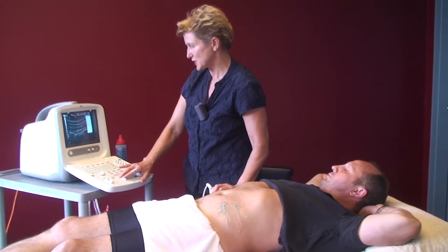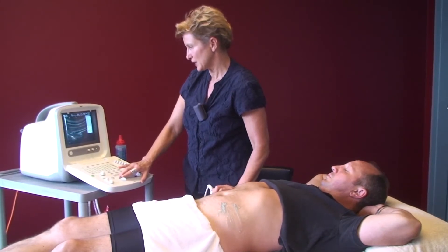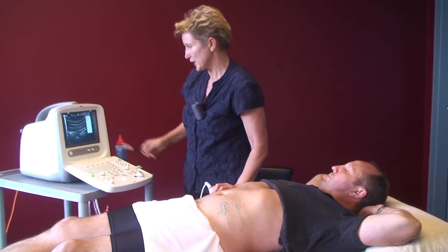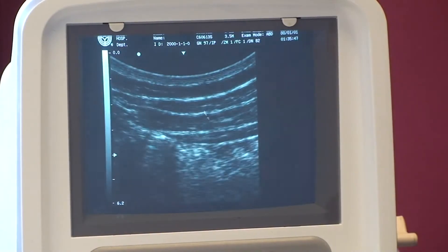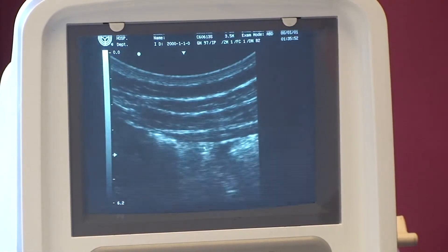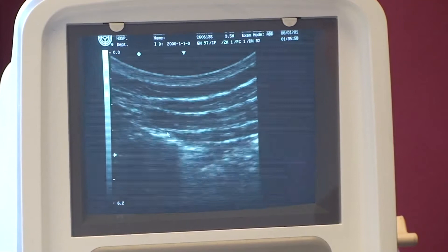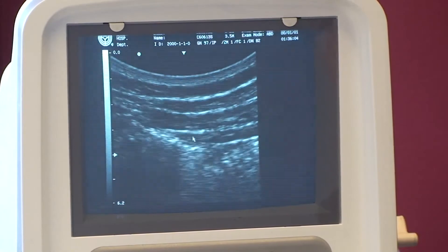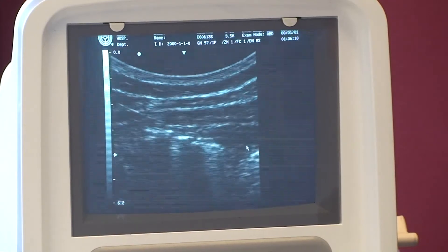The first thing I want you to do is just observe what happens — the client can see too. Alex, I want you to take quite a big breath in and breathing out. Now, what we want to look for in our assessment — I'll show you with the pen — is on the top we have our external oblique, then our internal oblique, then our transverse abdominus. We're particularly interested in the transverse abdominus and what its fascial slide is. Now I'm going to get Alex to do this the wrong way: contract, pulling your tummy in. That's what most people do — they brace all three muscles together.